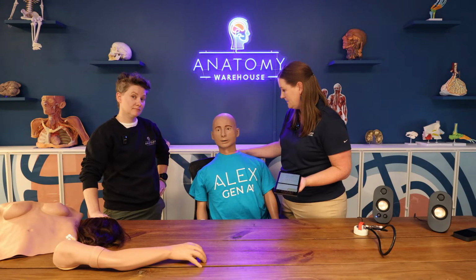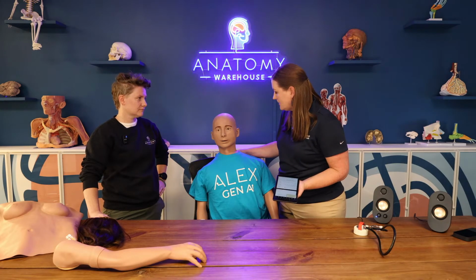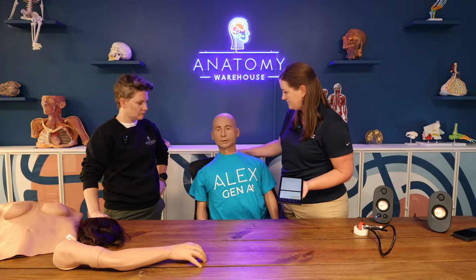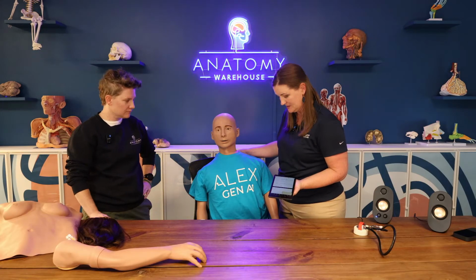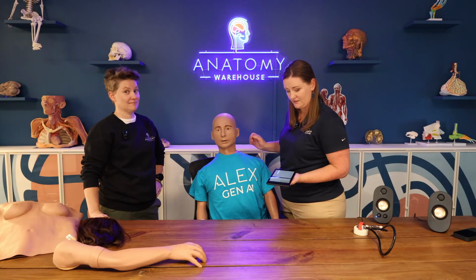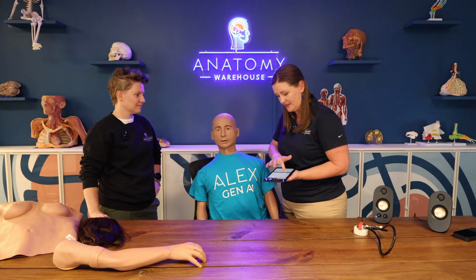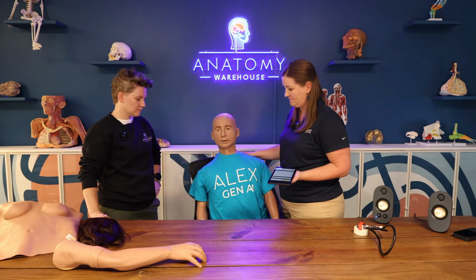Yes, I had a couple of drinks at lunch before the accident. Okay. And by drinks, do you mean cocktails, alcoholic beverages? Yes, I had 2 cocktails. Okay. And what type of cocktail was it? It was a Long Island iced tea. Okay. And approximately how long ago were those Long Island iced teas? I had them about an hour ago.